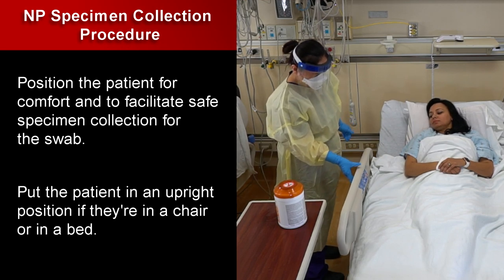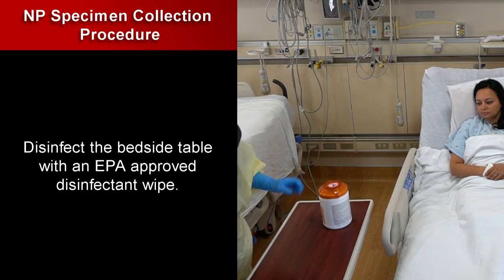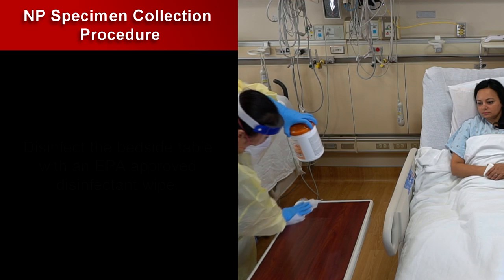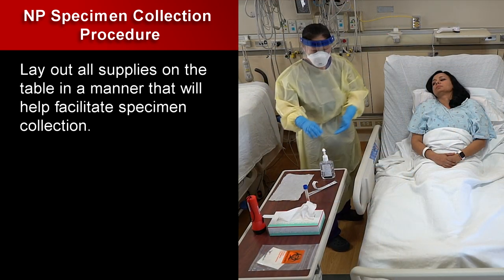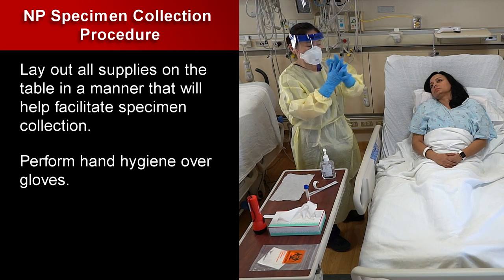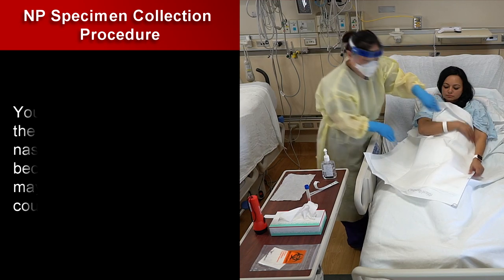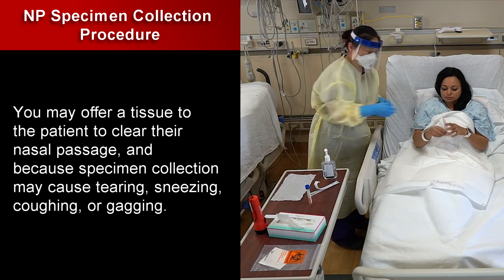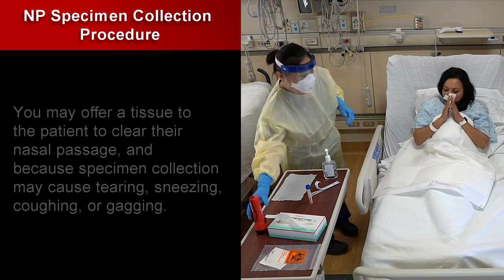Position the patient for comfort and to facilitate safe specimen collection. Put the patient in an upright position if they are in a chair or in a bed. Disinfect the bedside table with an EPA-approved disinfectant wipe and lay out all supplies on the table. Perform hand hygiene over gloves and place absorbent material over the patient to protect their clothing. You may offer a tissue to the patient to clear their nasal passage, as specimen collection may cause tearing, sneezing, coughing, or gagging.